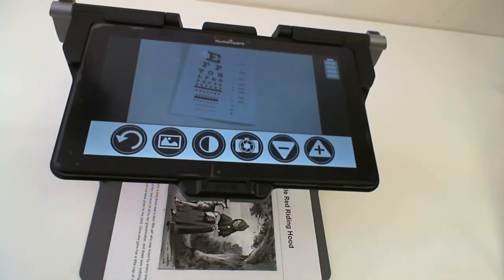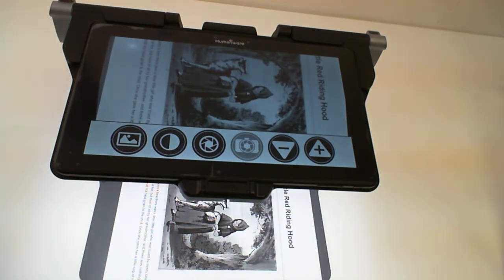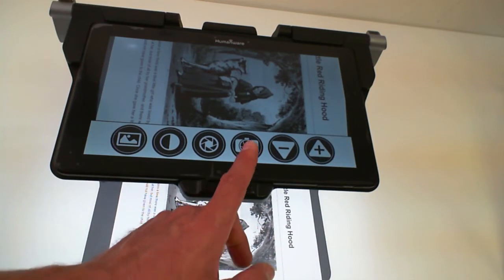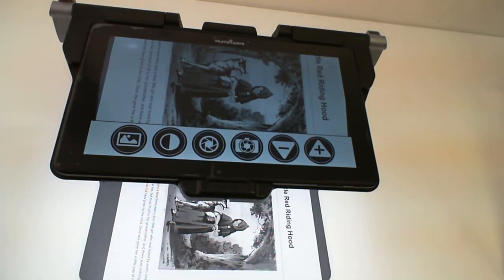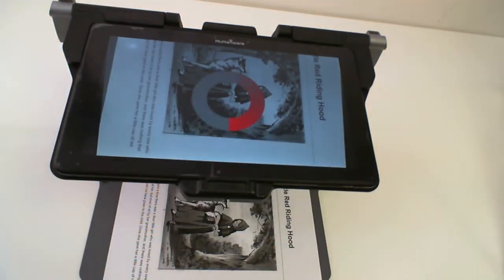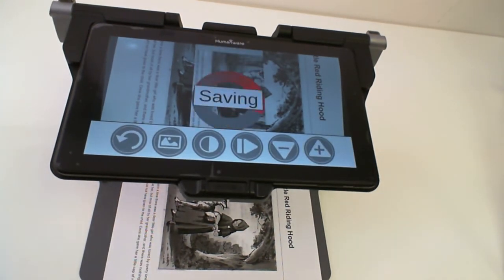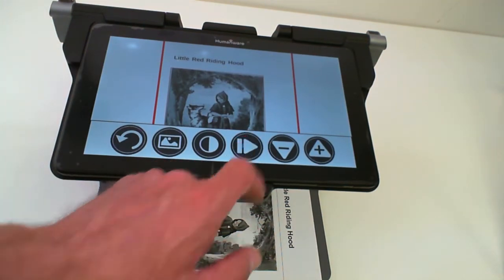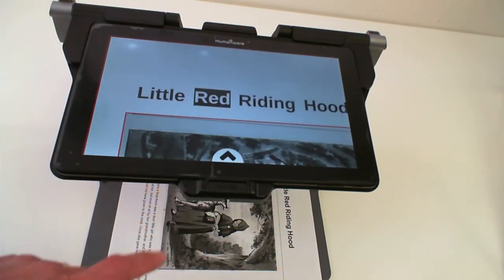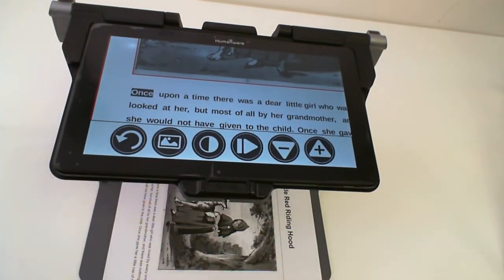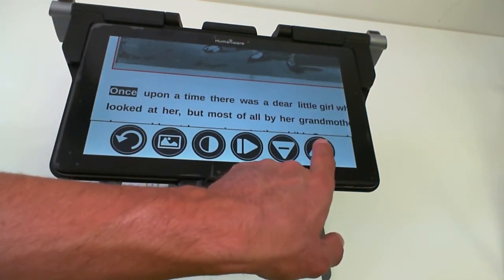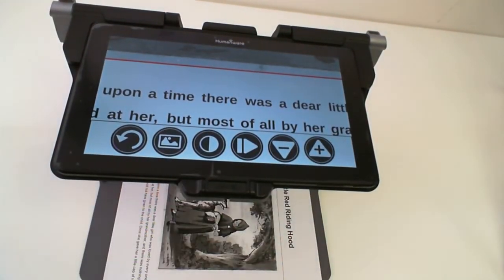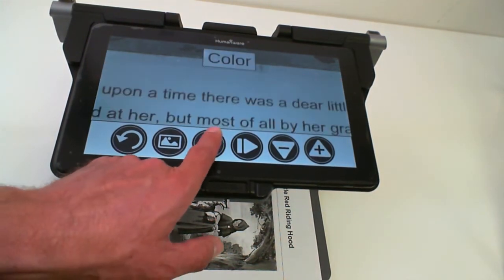If I go back to my Magnification application, my fourth button from the left is the Capture button. By pressing the Capture button, this will do the OCR automatically and save the image on the device. Once the OCR is done, I can start reading my captured image and pause it. I can zoom in using my plus or minus sign buttons, or I can change my contrast colors.